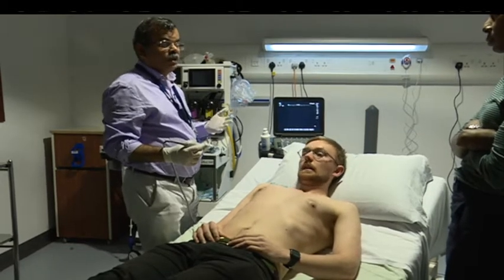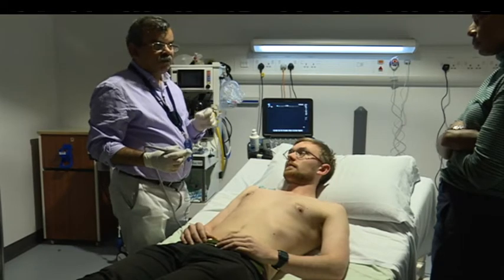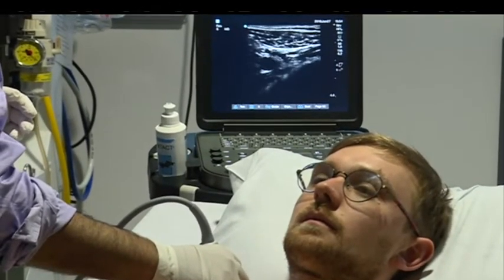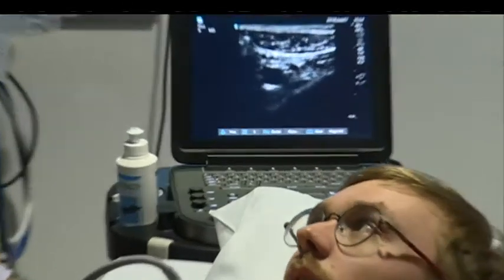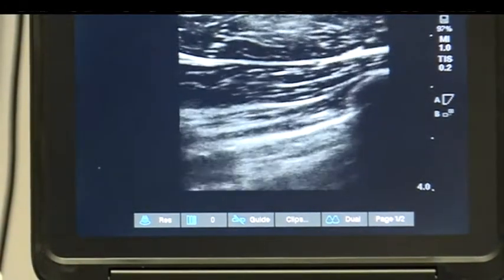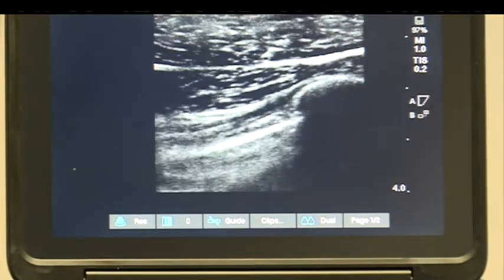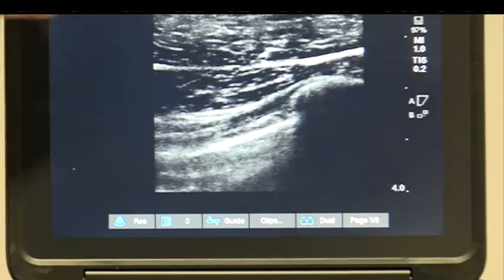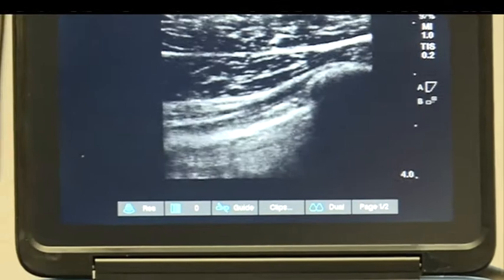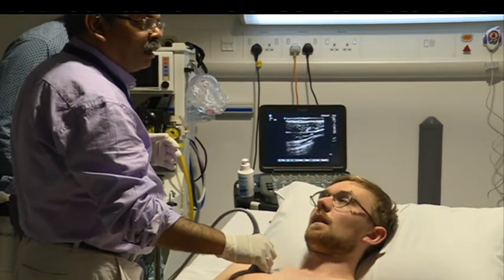PEC 2 seems to work well. The theory is that going through the muscle reduces pain from cauterizing of the muscle. For the PEC 1 block landmark, it is almost the same as an infraclavicular block — infraclavicular is lateral — but you move the probe a bit more medially and look for the thoracoacromial artery between pec major on top and pec minor below. Always identify the artery; you do not want to go through it. It is a plane block — put 10 mls of local anesthetic in that plane and confirm lateral and medial spread.